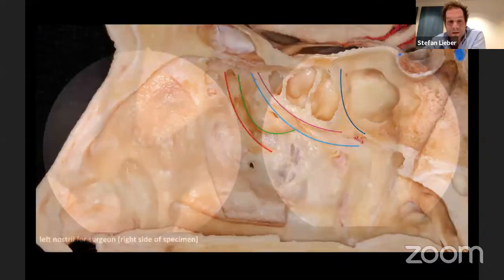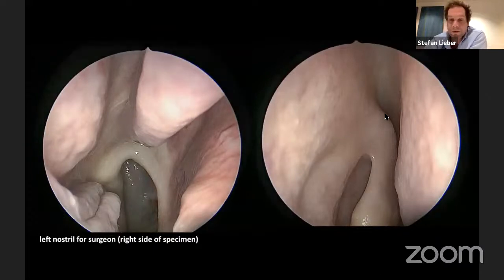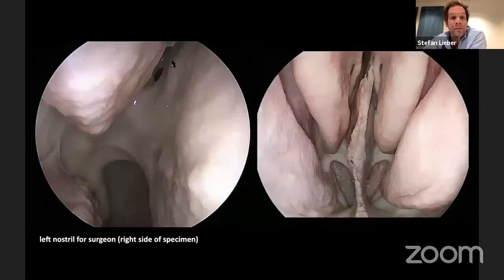This is now exploration of the nose via the left nostril. So we're looking at the wall of the maxillary sinus here, inferior turbinate, choana, septum, and middle turbinate. This is the axilla of the middle turbinate in the view versus superior. This is the sphenoidal ostium, which is sitting here on the sphenoidal recess of this diamond-shaped aspect of the rostrum.